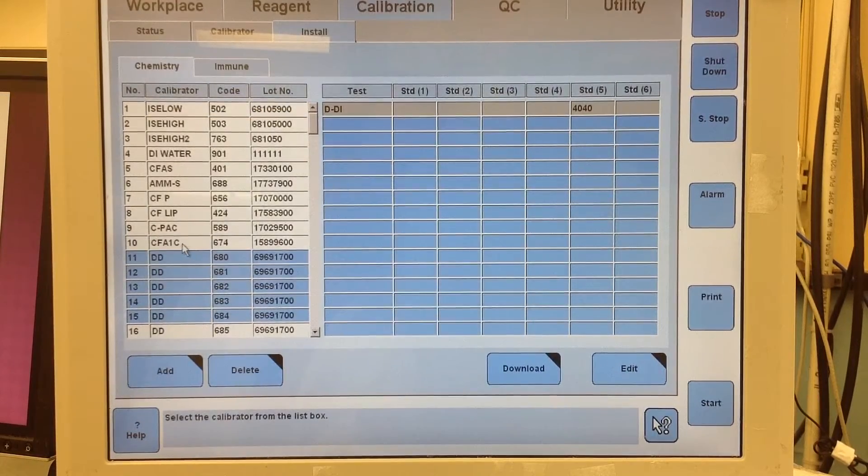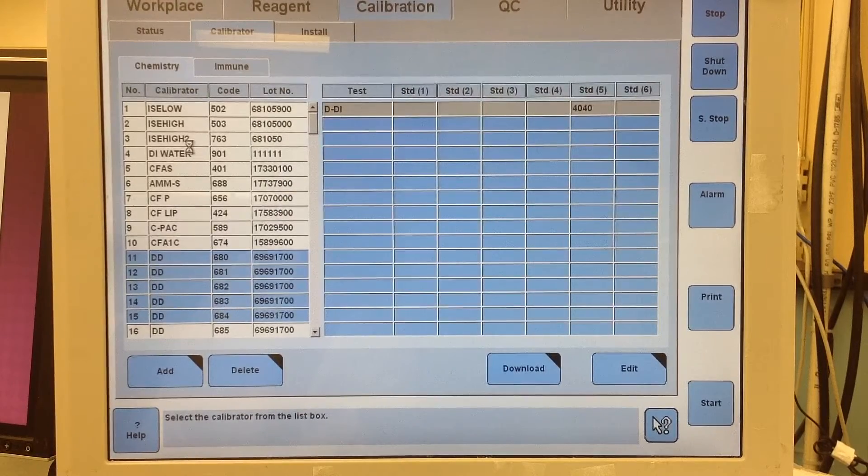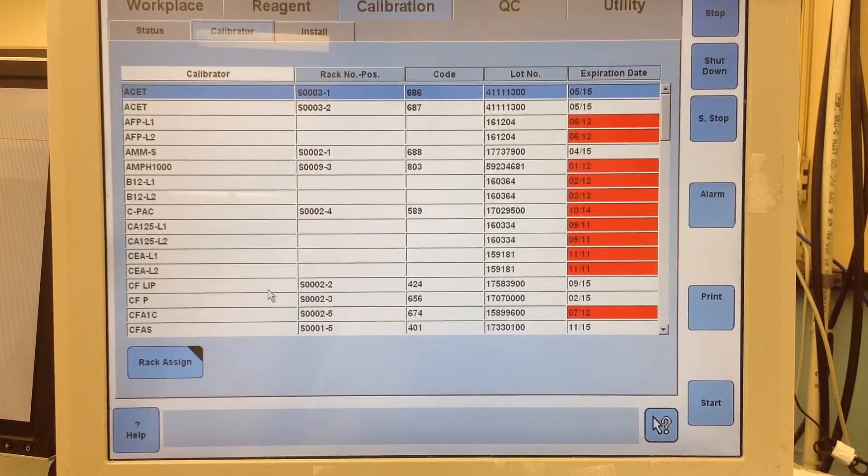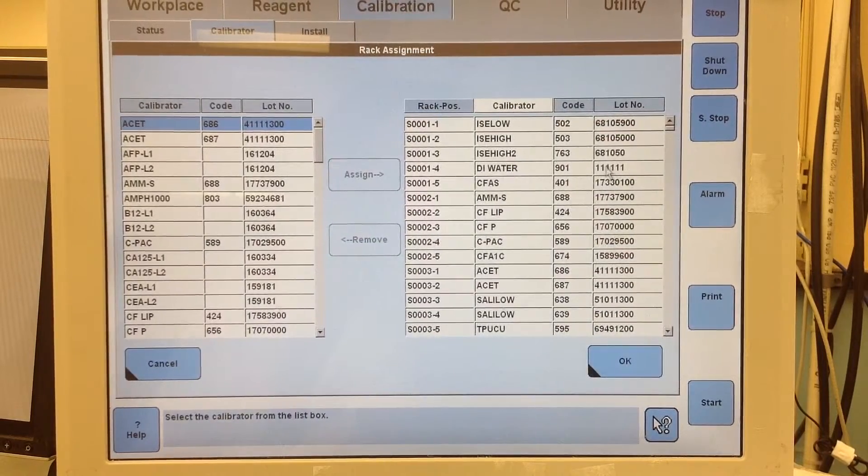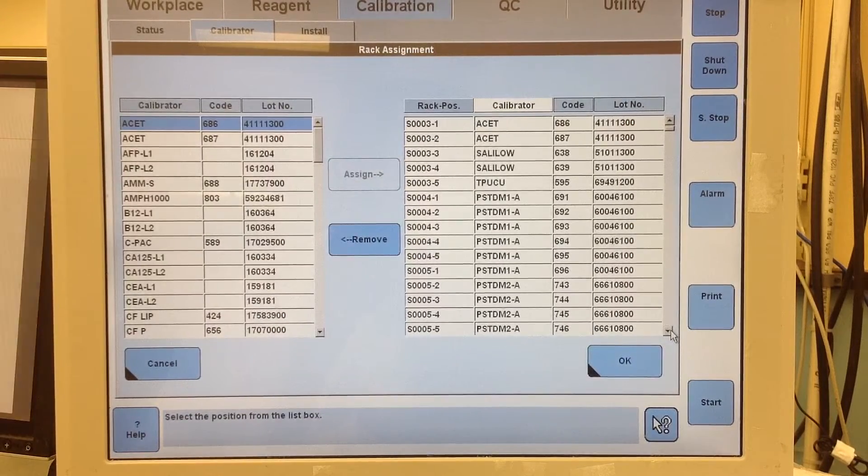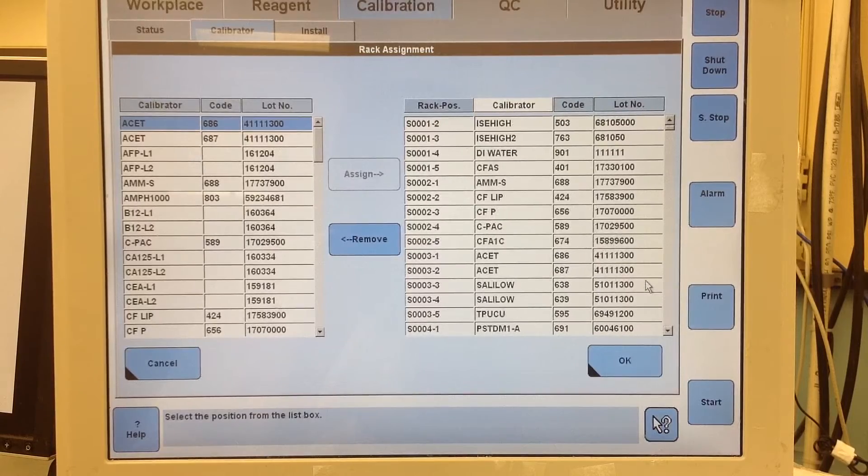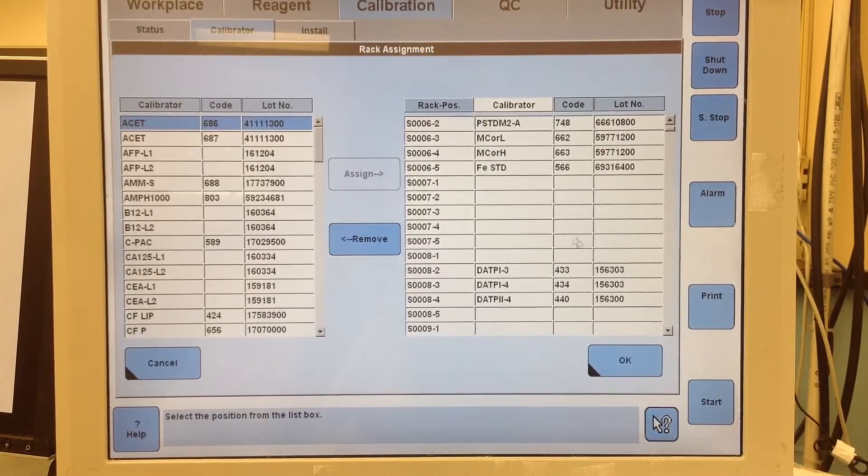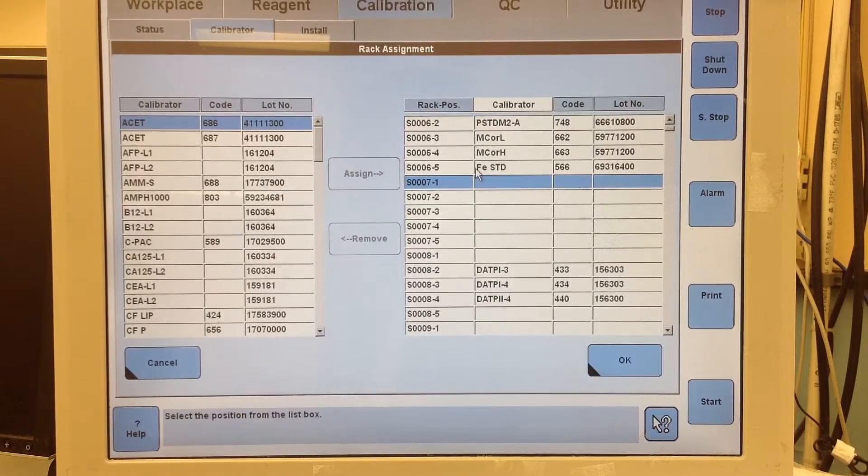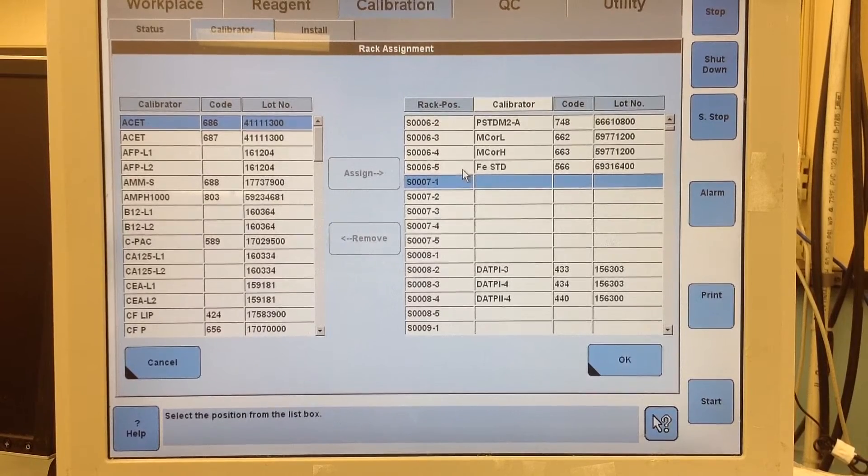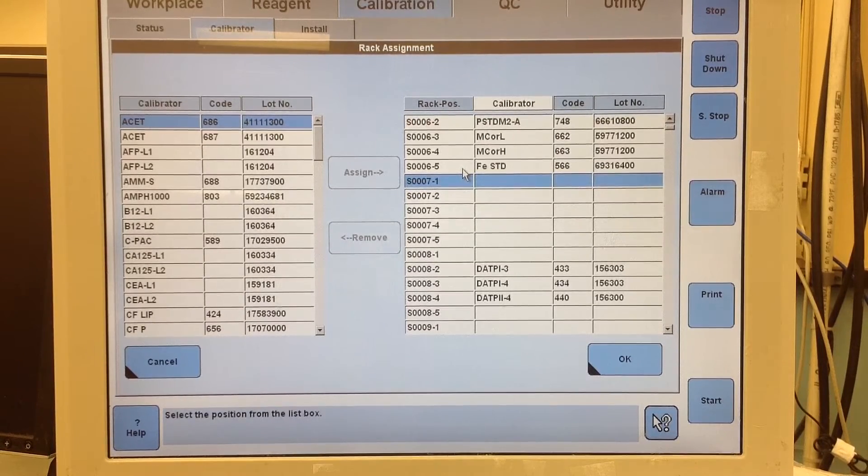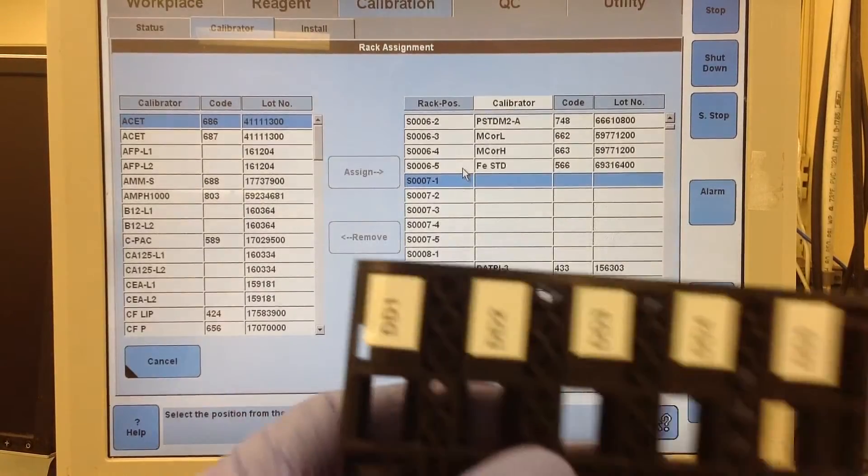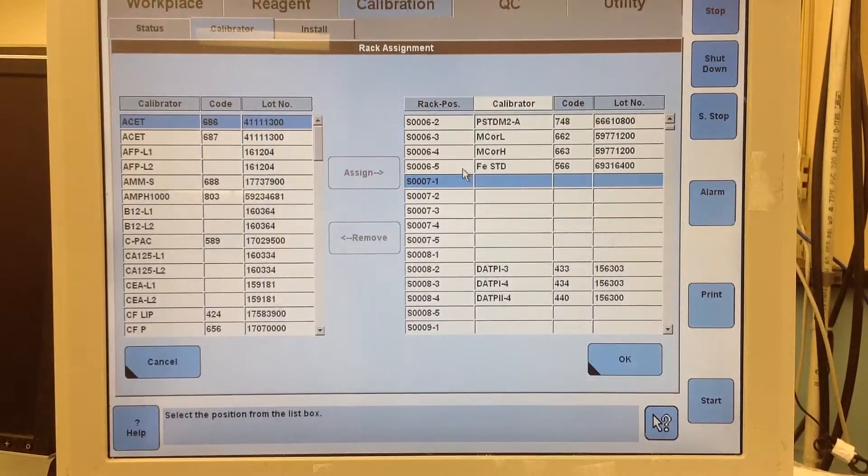Now there's one more thing you have to do. Since I deleted the old calibrator, I need to reassign all of these to a rack again. So you get rack assign. This will vary possibly for each facility. But the rack that we use, I believe is 7181. Which it is. So here's our racks. I use 7181.